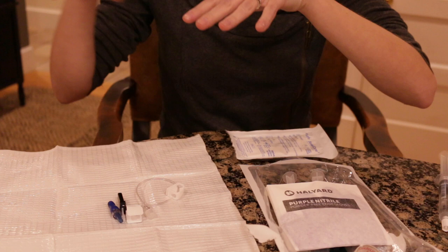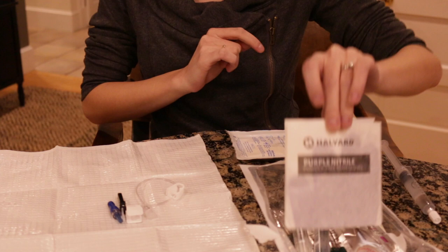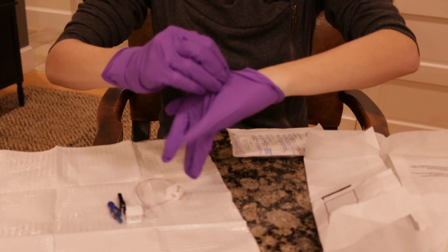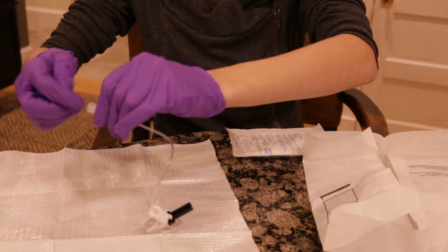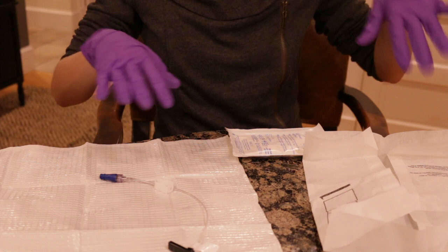At this point I will have already dumped my sterile needle and cap onto the sterile field, and that is where I will pick up with this procedure. I'm going to go ahead and put on my first pair of sterile gloves, which are from the dressing change kit. Once you have your first pair of sterile gloves on, you can go ahead and hook up your needle and cap, or extension if you are also doing an extension. All I have is my needle and my cap. Next I need to get my syringe prepared.